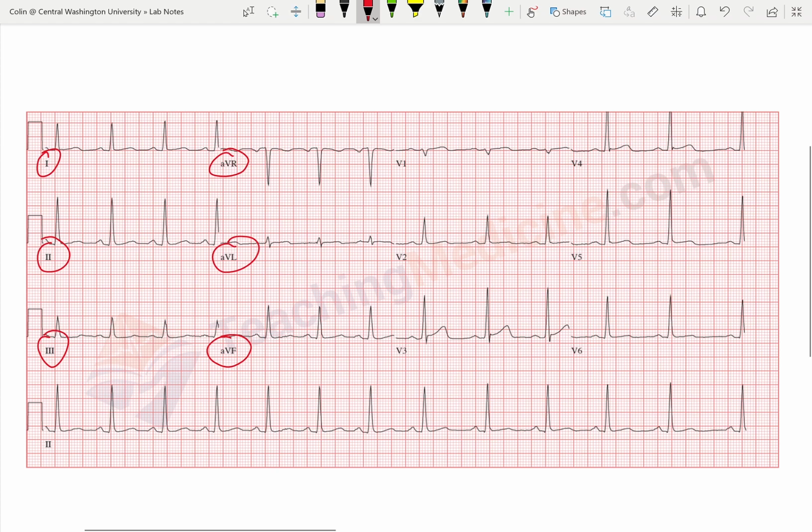diagnostic tool. So I'm never going to put someone on a 4 lead and say that they're having a heart attack. A 4 lead is really good for figuring out what rhythm they're in. For example, if they're in AFib, a long strip that's maybe 10 seconds long of just lead 2, kind of like the one that we have down here at the bottom of the page, is what a 4 lead can give us. So it's super useful, and you should always print one out because you always hook up a 4 lead first before you hook up a 12.